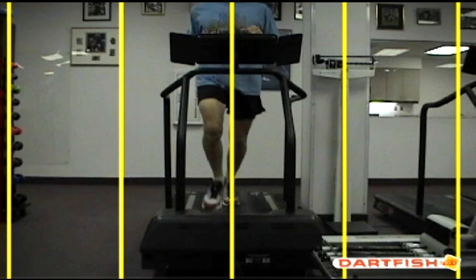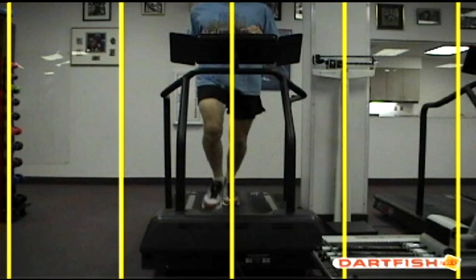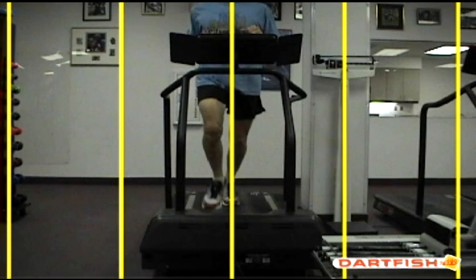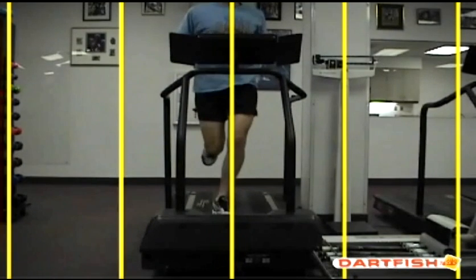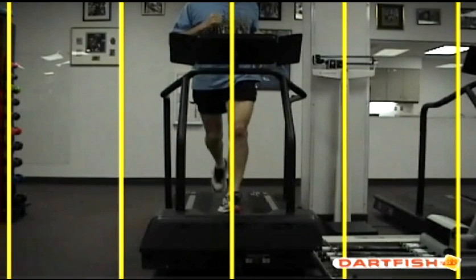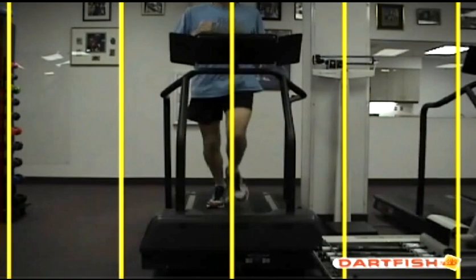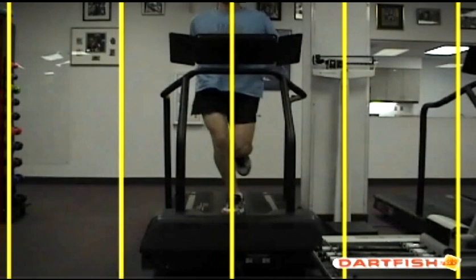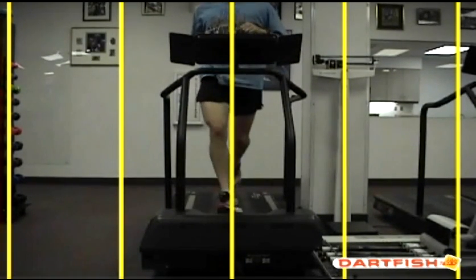Video 3 is an example of how we can use Dartfish to capture what is happening at the hip and knees. Using a front view, we can see that this runner has a tendency to cross his left leg over the midline quite excessively. Typically, feet would maintain about 6 to 12 inches in width during successive stance phases. Some runners have a tendency for the feet to actually cross the midline of the body while running. This can begin to cause problems in the hips or knees, including patellofemoral syndrome, IT band syndrome, and hip bursitis, to name a few.